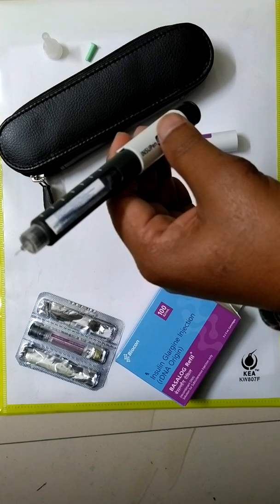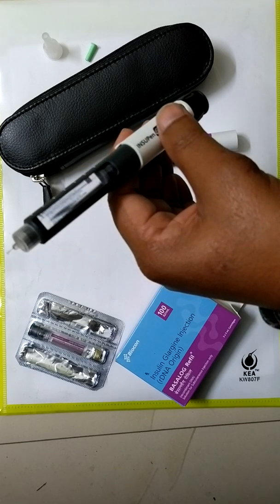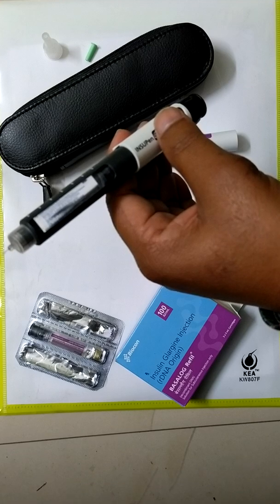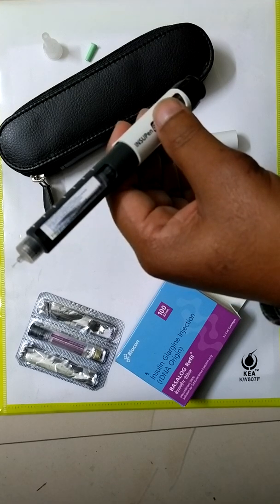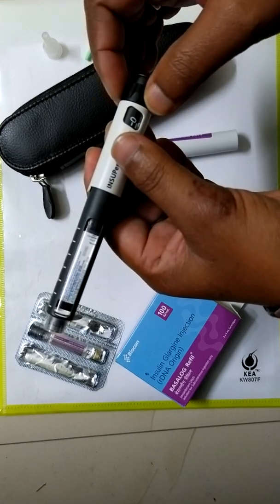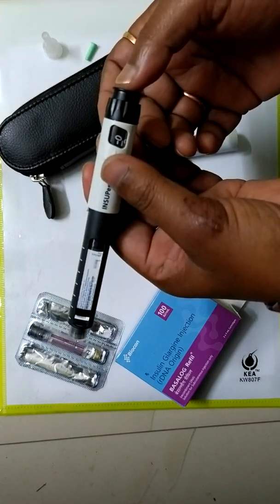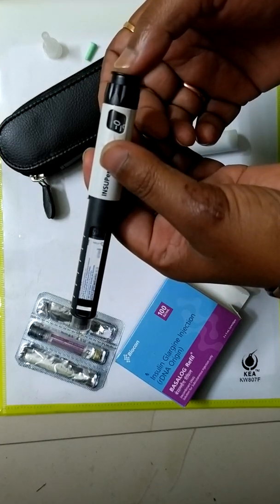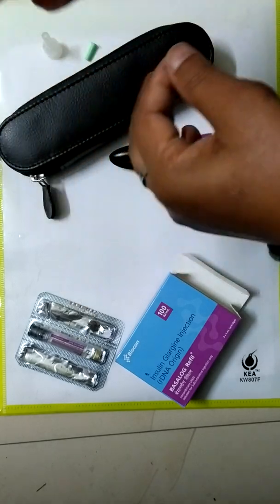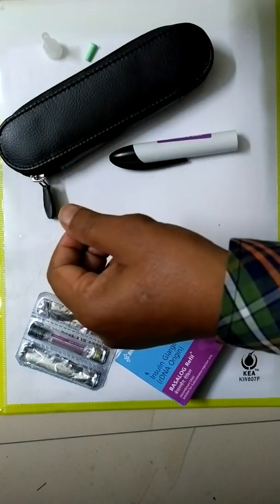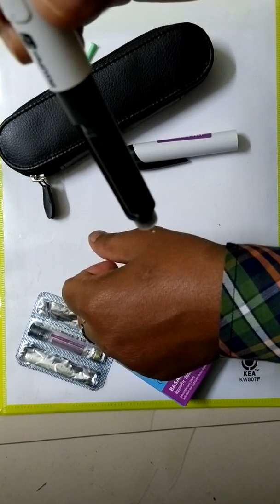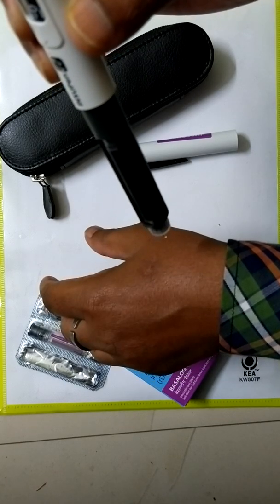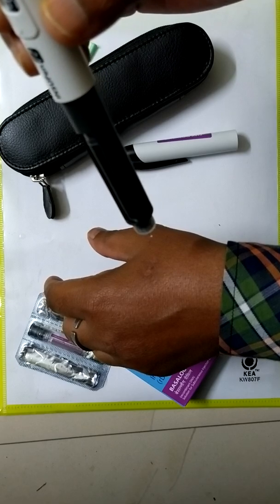And it is also required for the accurate dose. After dose selection, push the button to insert the medicine into the skin. And always hold the pen with the skin at a 90 degree angle.